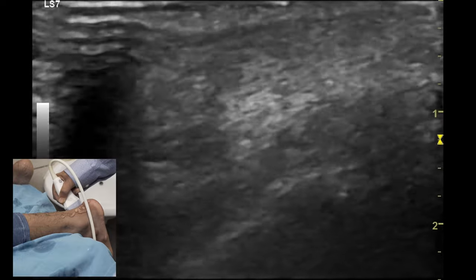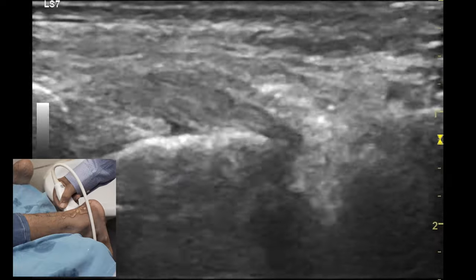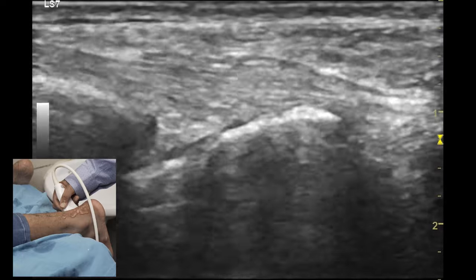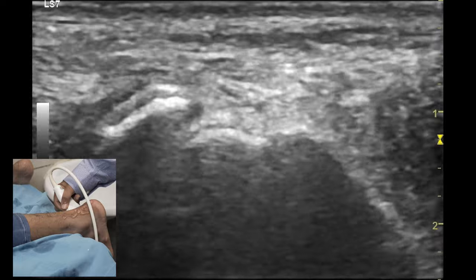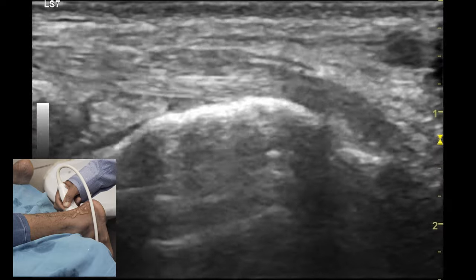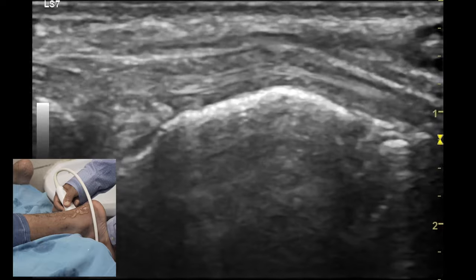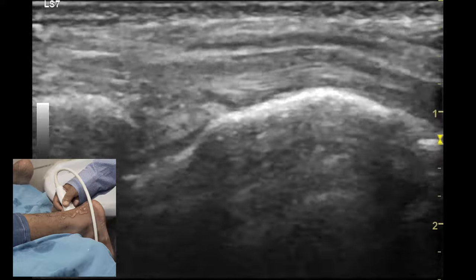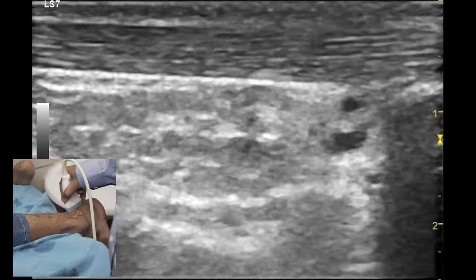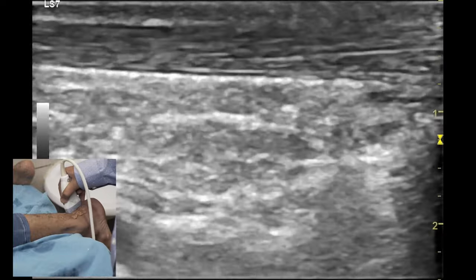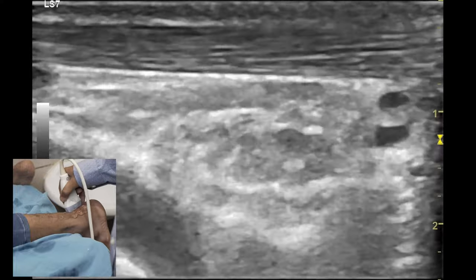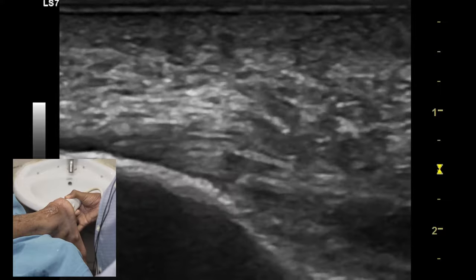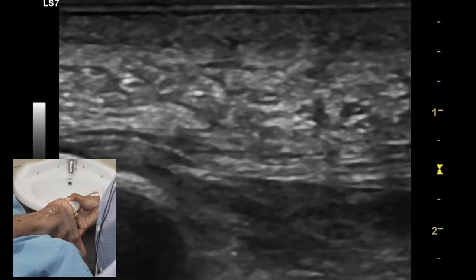By moving the transducer medially from the Achilles tendon, one can visualize the flexor hallucis longus tendon as an echogenic structure. Anterior to that one can also see the posterior tibiotalar joint space, and inferior to that one can also see the posterior subtalar joint space. To confirm the tendon on dynamic examination, one performs flexion and extension of the great toe and smooth movement of the tendon is visualized. Dynamic examination of the tendo Achillis is performed by doing plantar flexion and dorsiflexion, which shows the smooth excursion of the tendon as well as the underlying flexor hallucis muscle belly.